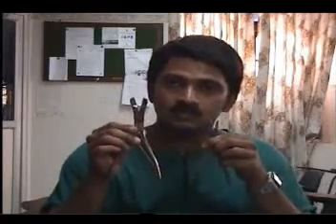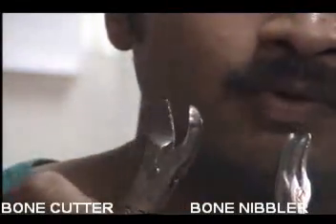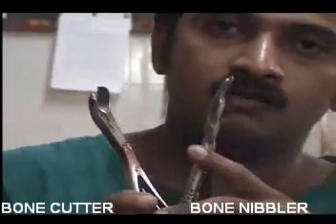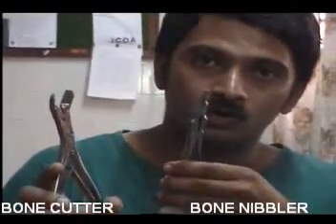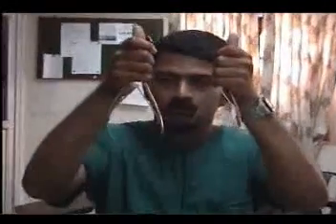Do not confuse the nibbler with this — this is the bone cutter. The nibbler has a jaw which is similar to a spoon, but the bone cutter is simply shaped like scissors. The nibbler is used to nibble off or chew off small pieces of bone, whereas the bone cutter is used to cut and break sharp pieces of bone. Do not confuse these two — they both look alike, especially the handles, because both have springs on the handles. But the ends are very much different.